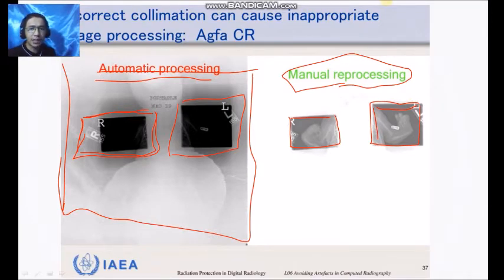Okay, so if we have a very dark radiograph, the computer system would not actually display the radiograph as very dark. Now, it would actually display the radiograph as if you have an optimal na contrast, as if you have the adequate contrast and density required for the examination. Bahala pag even if your factor is too much, your factor is too less, the computer system can automatically adjust. Now, that is the automatic scaling system, automatically adjusting to the required contrast and density based on the examination that you have selected.